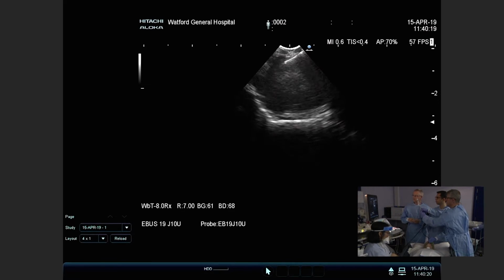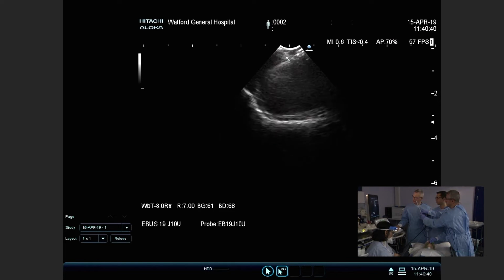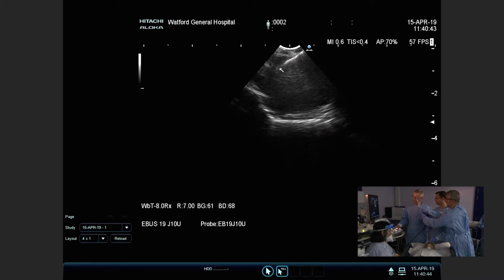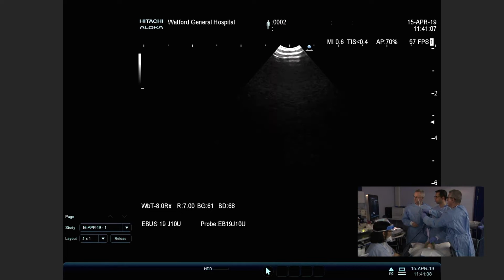Now I'm actually in the periphery of the node here, and actually I don't mind that. Our pathologist has taught us very well, and malignant material moves from the periphery towards the centre. So rather than being in the centre of the node, you're actually targeting the periphery, traversing on the very edge of the node. We found in our experience that you're much more likely to have viable tissue here as the node is growing, whereas in the centre, you may have some necrotic material. Intuitively, you avoid the central necrosis. It feels firmer here, actually, funnily enough.